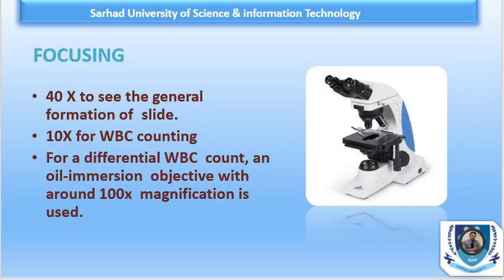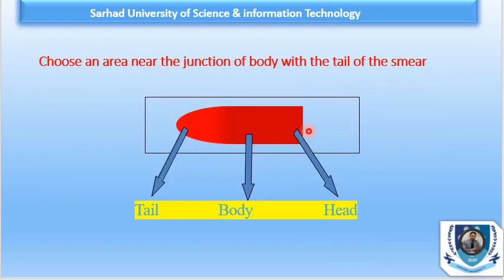The most important step is focusing. Once the peripheral blood smear is made and dried, we place it under the microscope. We first focus on low power and observe the general formation of the slide under 40x. For differential WBC count, oil immersion objective at 100x magnification is used, and once focused, we start counting.